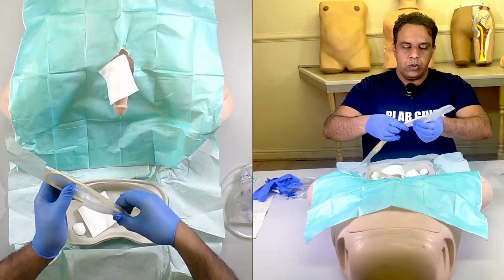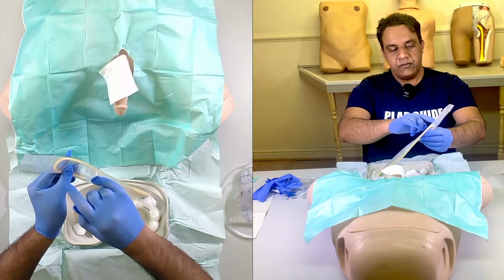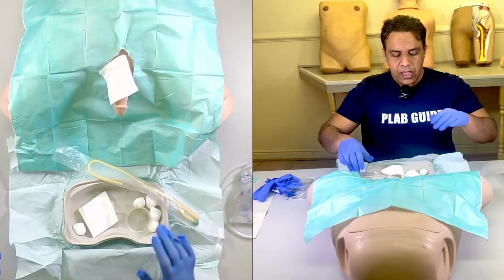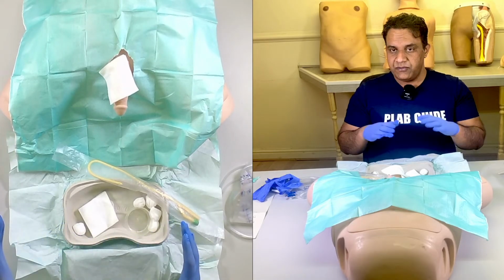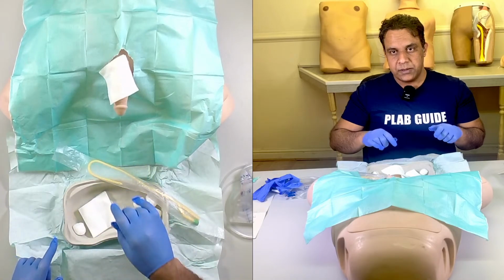Now if you look at the catheter, it has a piercing on the front as well as on the other end. At no point, even if you have changed your gloves, even if those are new gloves, should you touch the tip of the catheter at all.